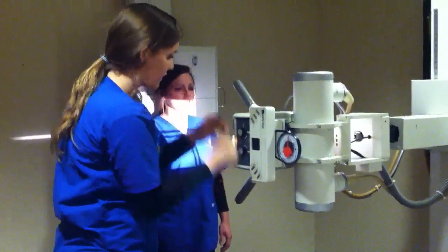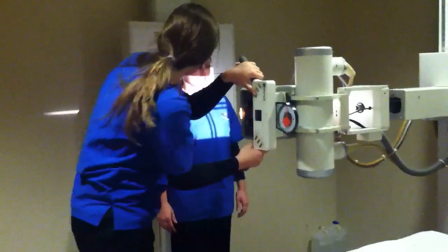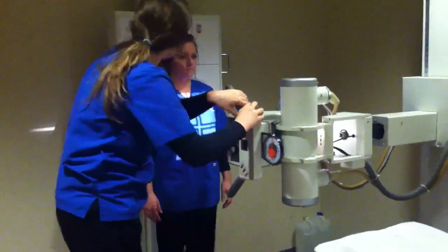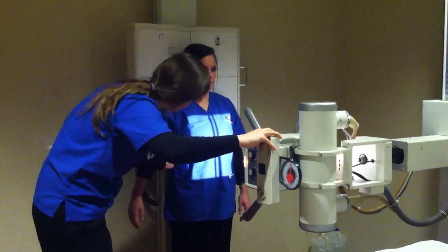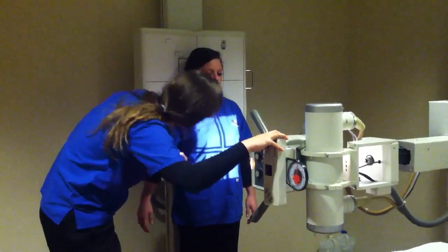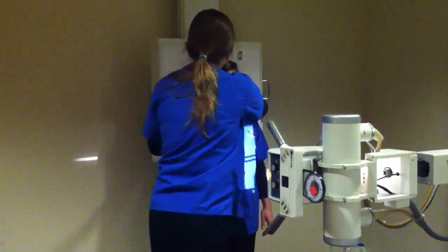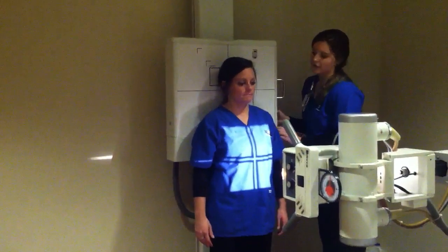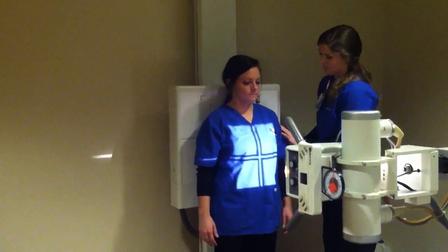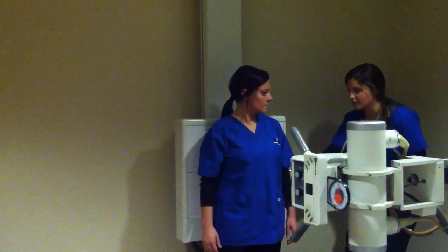So bring my tube into 40 inches. This should have the same collimation as before, 14 by 17. And I'm going to center 2 inches above the iliac crest. And the top edge of the cassette should be at the level of the axilla. Make sure it's centered to the midline. And bring my bucky down. Make sure it's lined up.